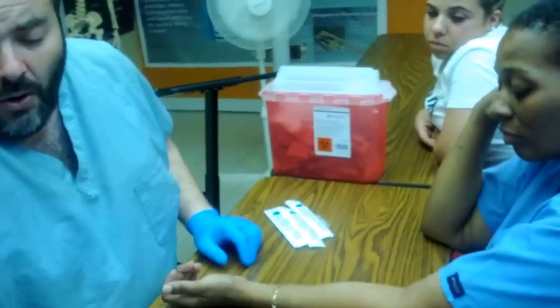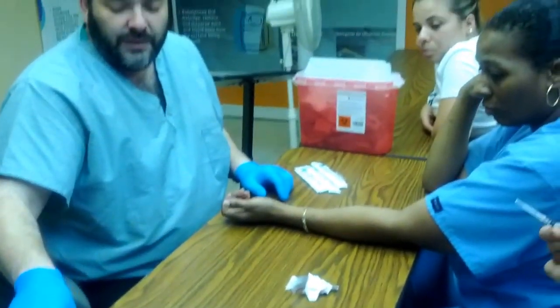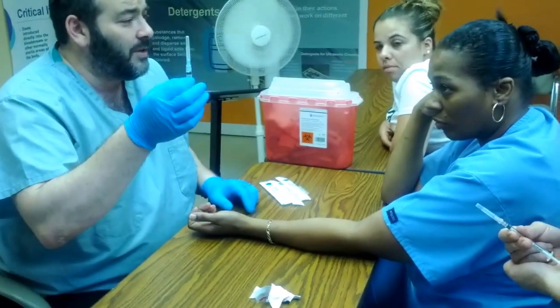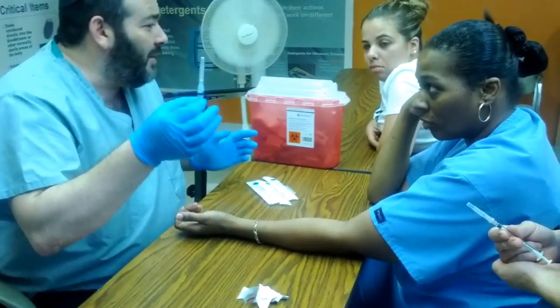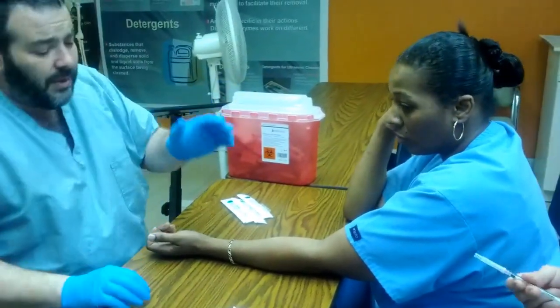Now, all the stuff that you have used, you're going to be throwing out, okay? The rules of medicine are such that when in doubt, throw it out. So if you don't know whether it's been used, unused, even if there's a shadow of the doubt, you're going to throw it out. So I'm going to throw out the syringe and I'm going to use the next one.